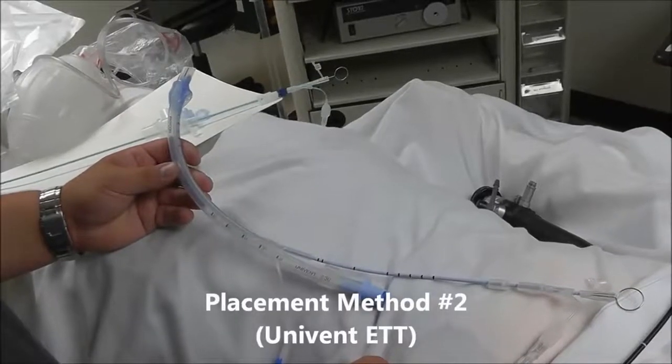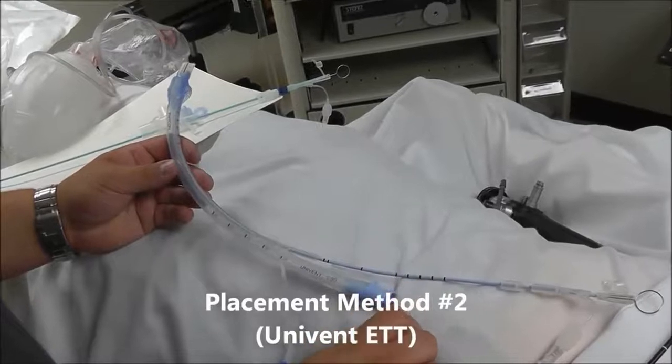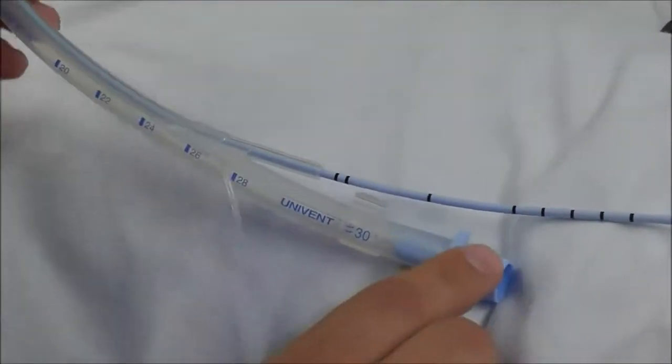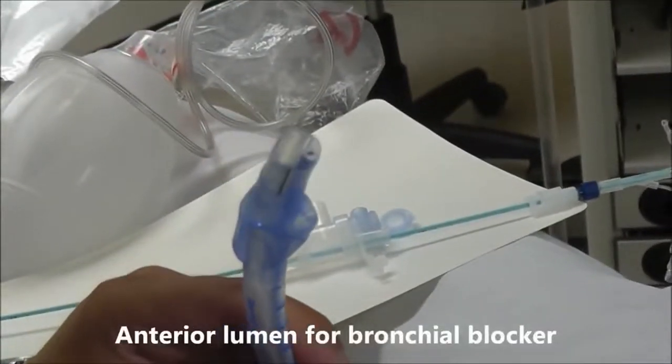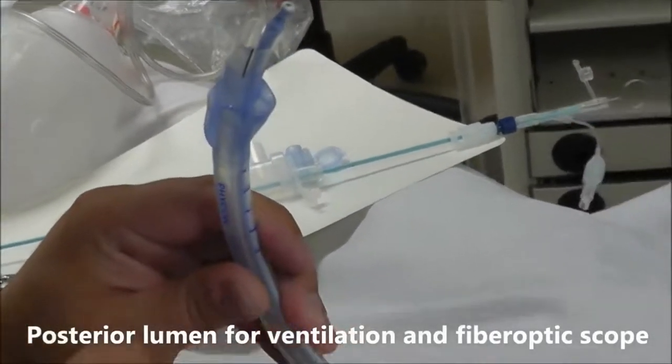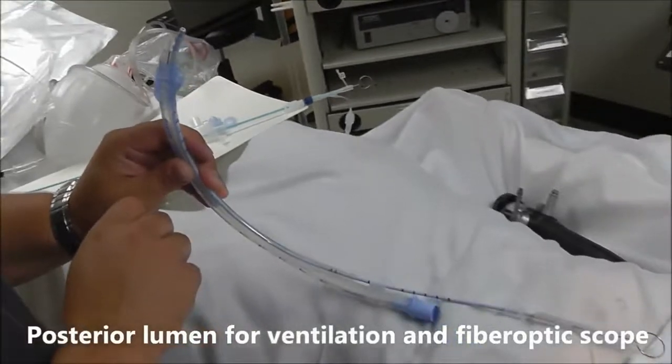Another method we have to placing a bronchial blocker is using a specialized Univent Endotracheal tube. The difference about this endotracheal tube is that it has two lumens. One lumen is dedicated for the bronchial blocker. The other lumen is used for ventilation as well as the fiber optic scope.